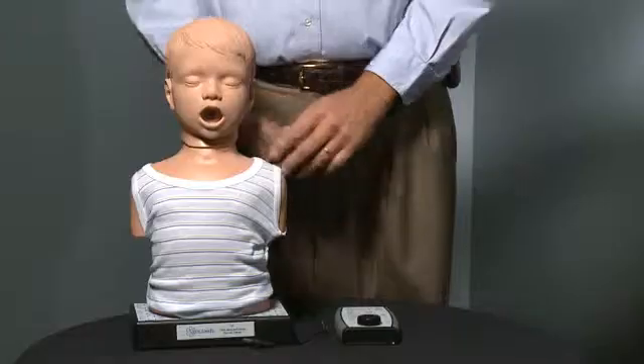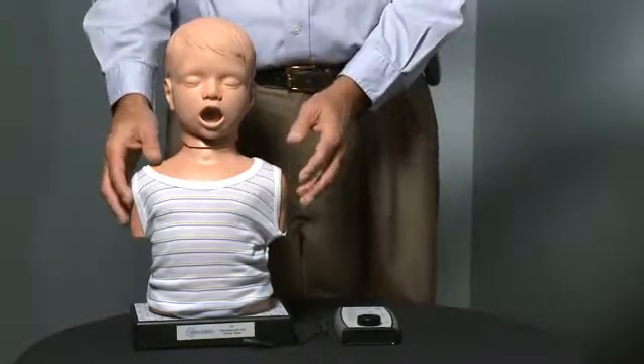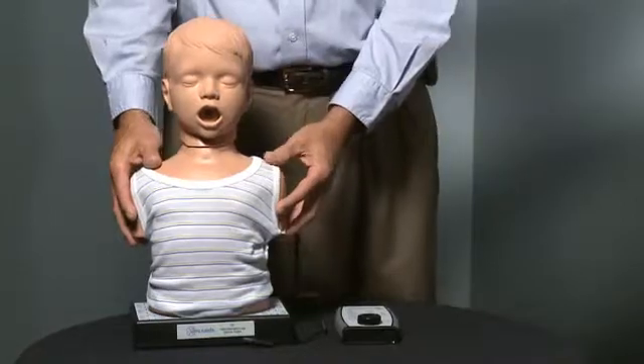We're here today to introduce a new product called the Child Heart and Lung Sound Trainer. Item number is 030, and its purpose is for new EMTs or people who haven't heard pediatric sounds in a long time to be able to listen to the correct locations on the product as you would with a child, and to listen to heart, lung, or voice sounds that help complicate the issue of listening to the first two.